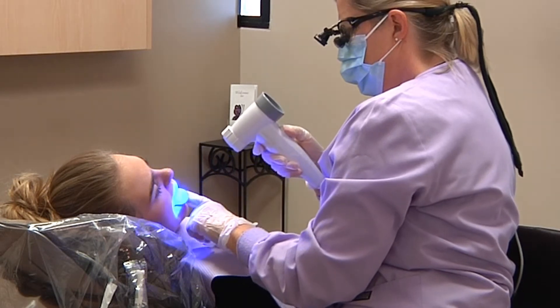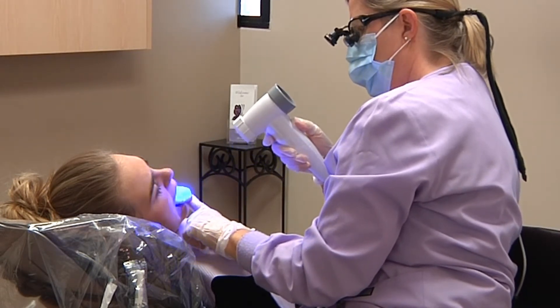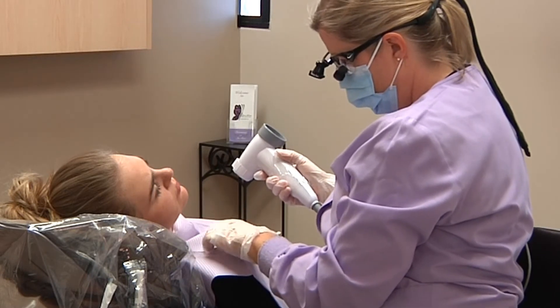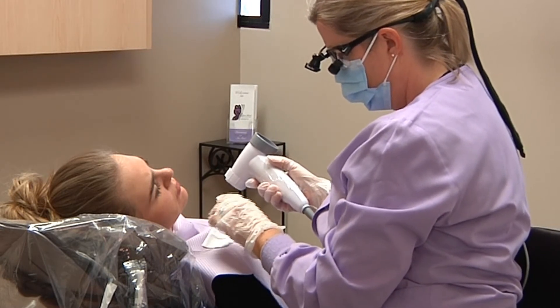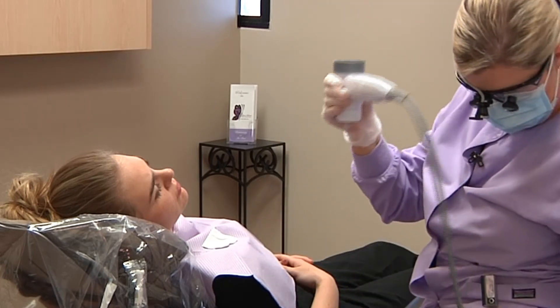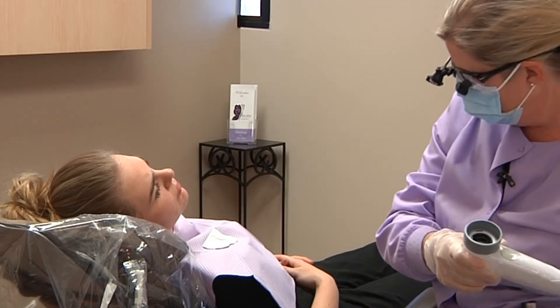Stick your tongue out one more time. So April, your lips, your cheeks, the tongue, the floor of the mouth, the back of your throat are all perfectly clear. And we will be sure to check again in one year.